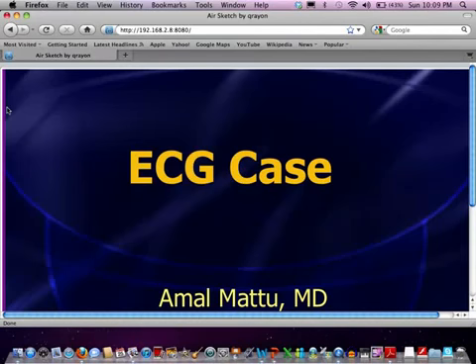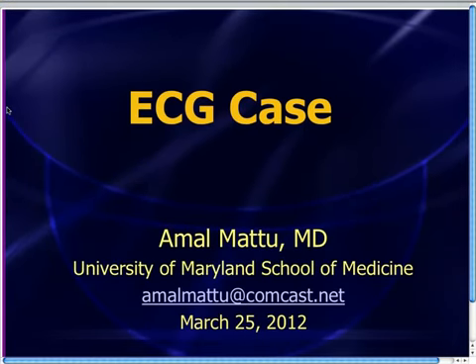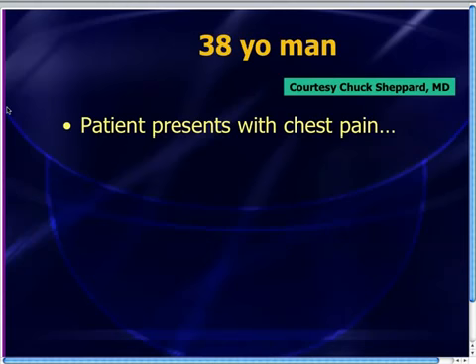Well, welcome everyone to the ECG case for the week of March 25th, 2012. This week we've got a great case, and I would say it used to be kind of a complicated case, but now this has really become a bread and butter case. I've heard that these type of cases are even showing up on the board exam, so this is something that you absolutely have to know.